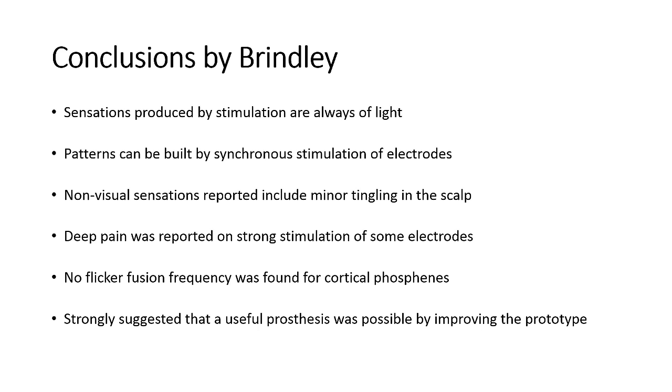Non-visual sensations reported included minor tingling in the scalp. However, deep pain was reported, and this was hypothesized to be due to the interaction with the meningeal pain fibers and was a major cause for concern. No flicker fusion frequency was recorded, and this refers to the frequency at which the phosphene is said to flicker, and there was no correlating data in order to find a particular frequency.